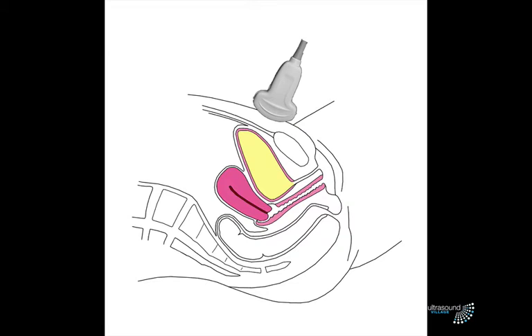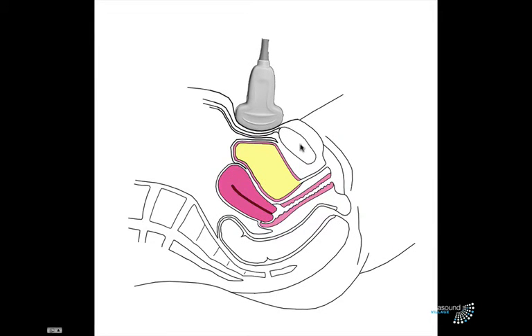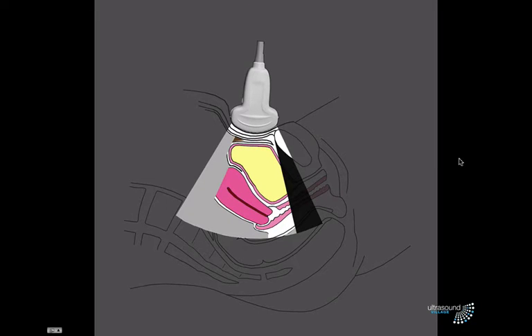So you again put your probe on longitudinally. Now, without pushing in, you'd expect to see shadow from the symphysis pubis, bowel gas here, but you are able to see through the bladder, and you should be able to see this bit of the uterus. If you push in, you should see even better. Here we go. This is what we should be seeing if we push in with a patient with a full bladder. Bit of shadow here, full bladder, uterus, nice endometrial stripe, vaginal stripe, and some bowel shadow and bowel gas behind.